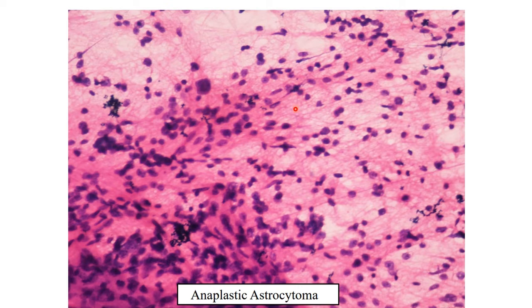So what do you see here? Yes, the cells are pleomorphic. Pleomorphism is just catching your eye here. Background looks fibrillary, and the cells, yes, they have a high N by C ratio. Yes, they look very pleomorphic. Some degree of mitosis can also be seen here. So you can make out the mitosis, right?